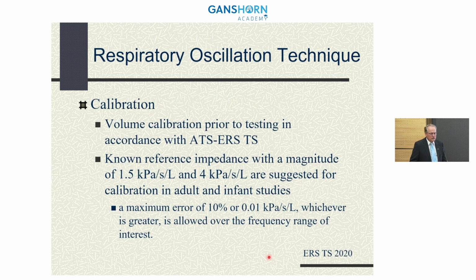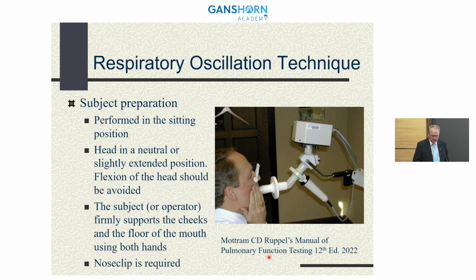So what did they use for setting up the instrument? First of all, the instrument does need to have calibration verification, and we verify the resistance by using a known resistive element in place, and all of the various instruments have a verification of resistance algorithm when you're performing the test, and they have a maximum expected error rate of 10%.